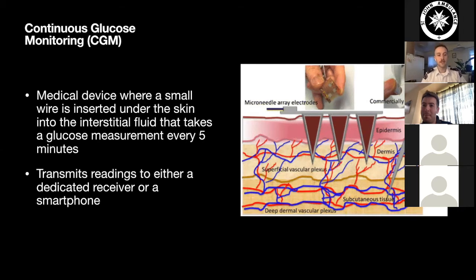And then when it starts dipping really low, down to about 3.1, it gets very angry and actually sets off a non-mutable alarm, which is really designed to wake you up in the middle of the night if your blood glucose is going super low. They are a really incredible tool. I can't overstate that. Being able to understand what's actually happening and seeing trends in your blood glucose, versus just 4 finger sticks a day, does make a big difference in being able to actively manage your diabetes.